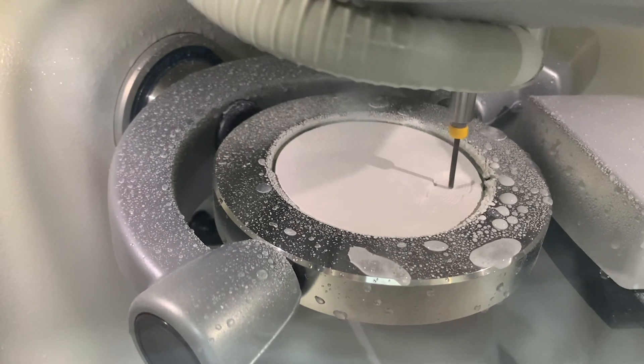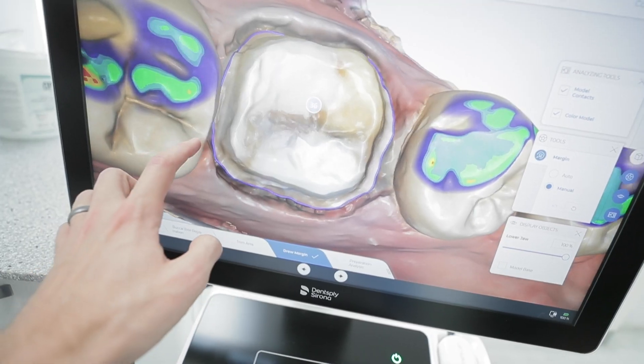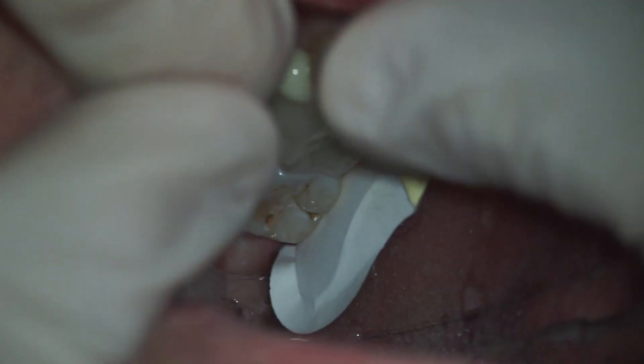That crown will look exactly like a tooth. It goes on the tooth that we trimmed upstairs, and then you've got a brand new crown in a day — without having to get all that goo in your mouth.